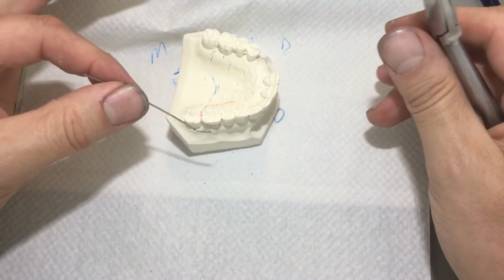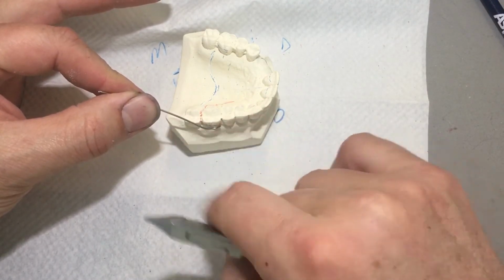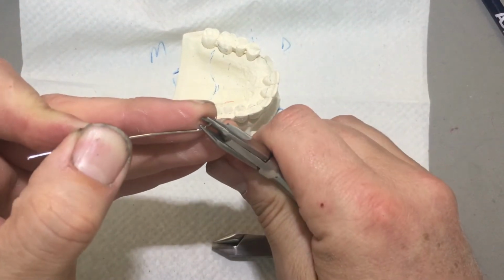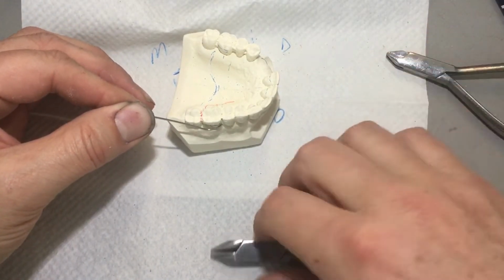Now this is kind of 3-dimensional bending. We've got to come this way, but I also got to go mesial buccal, fit the contour of the tooth. So I think your 3 prongs might come in handy here. I'm just going to tip the tip in around the corner.